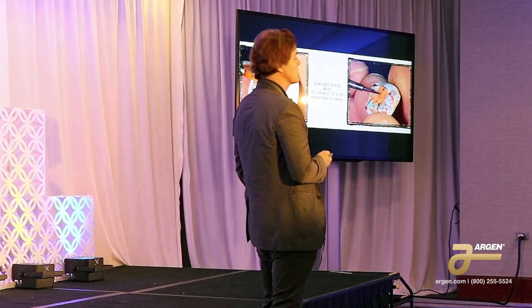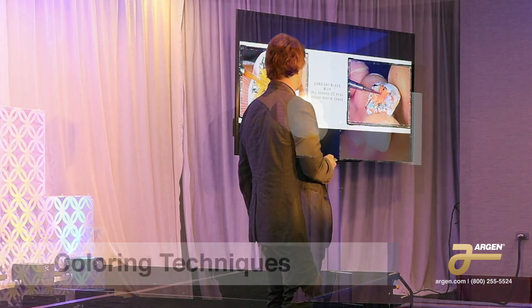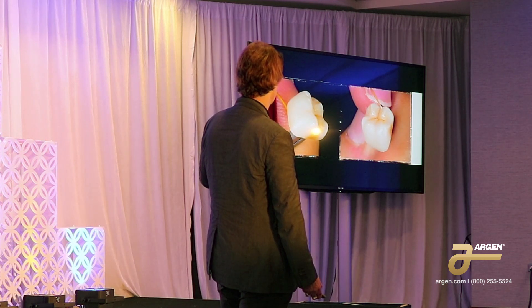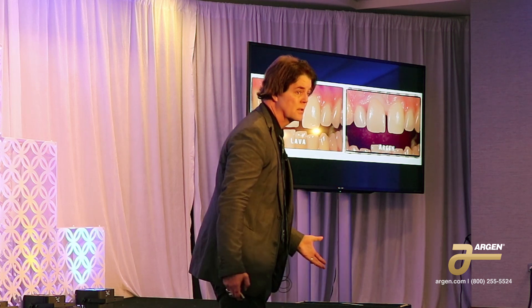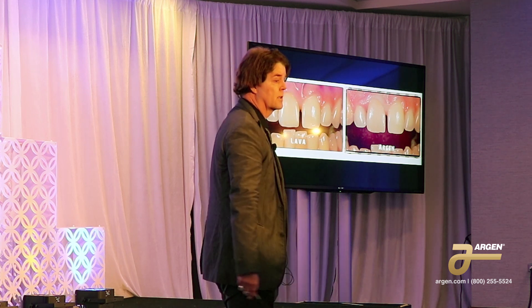Then I'll paint the occlusal — I just put orange color on so you can see it. Now I'm going to go ahead and fire it. I usually use a little bit of proximal color and maybe some white ochre on the cusp tips. Because I'm at a university, I made it out of two different materials — Lava and Argen — and you can see that's monolithic.